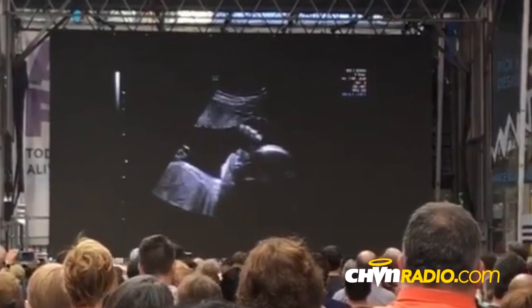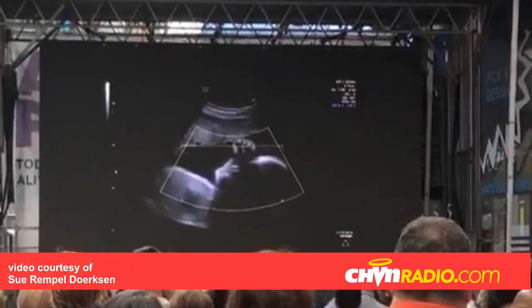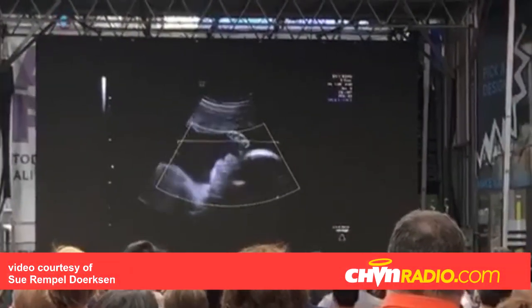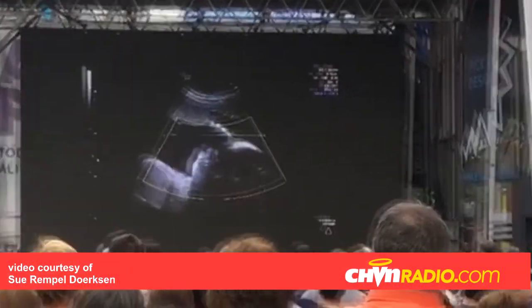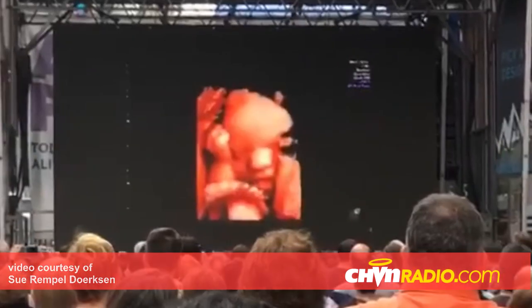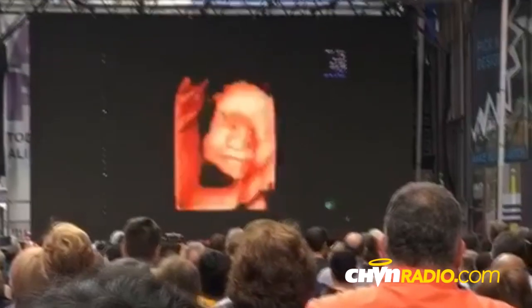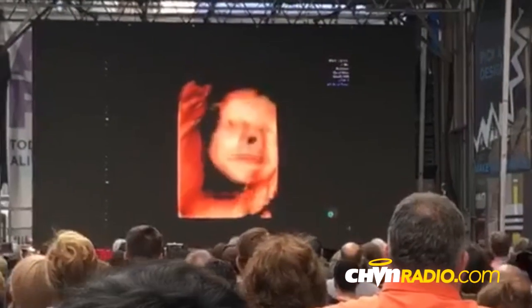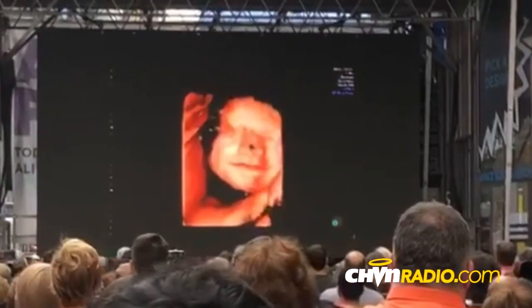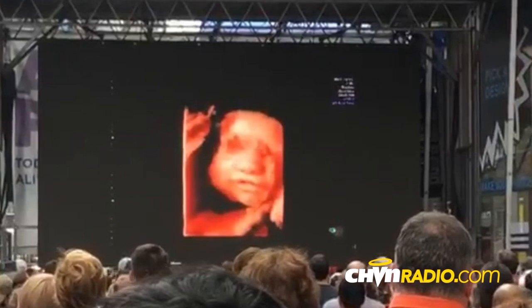There are times, as you can see here, that as baby moves, baby will move in and out of that sample box. We see the nose — the nose moves in and out of the sample box, so we lose part of the image of the nose.